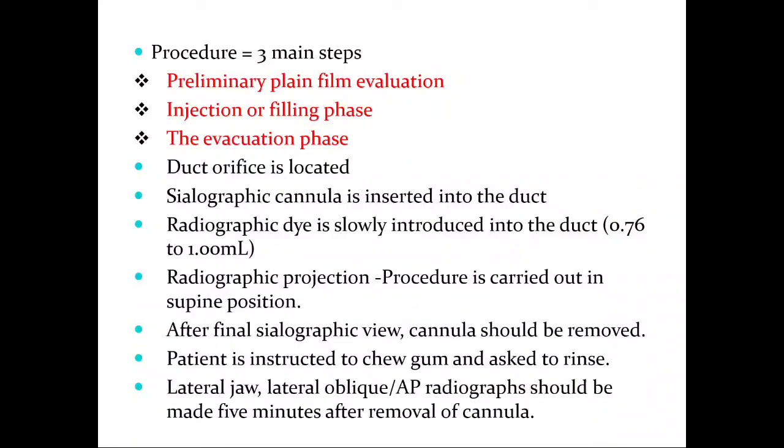And once the images have been taken, the patient is asked again to suck the lemon wedge so as to evacuate the contrast, the cannula is removed, and then we take the radiographs of the salivary gland itself almost 5 minutes after the removal of the cannula.